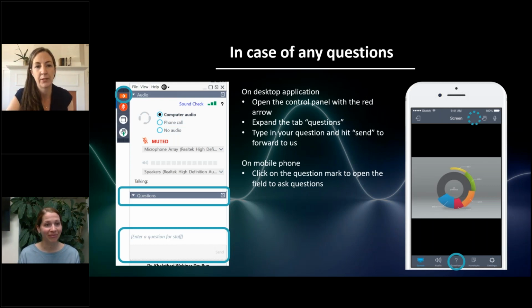Yeah, I think that's a really excellent point. So in our pupillometry work, for example, we did look at the combined response to see if we could improve the diagnostic capability as assessed with the receiver operating characteristic area under the curve. And I think the exact same thing will apply to combining pupillometry with the photopic negative response. As with any diagnostic test, there are just so many variables affecting it: age, gender, what time of day it is, the lighting in the room, et cetera. And in the numbers that we've been able to do for our studies, we just don't have the statistical power to consider all those variables.